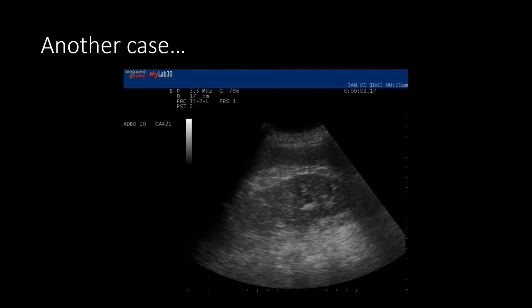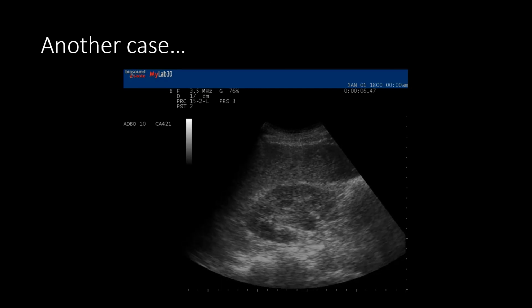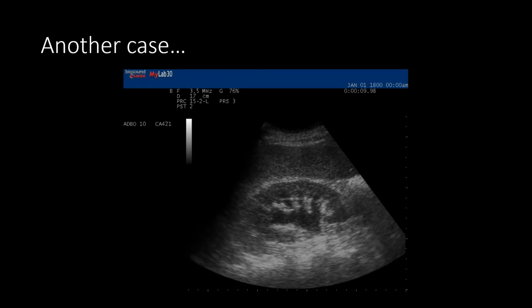As you can already recognize by now, this patient had obvious bilateral hydro, so the treatment for his CHF was not nitrates, not furosemide, it was a Foley catheter. His creatinine came back at over 1,000. So, very useful to sort out your patient's diagnosis at the bedside when you first assess them. Why wonder when you can know?